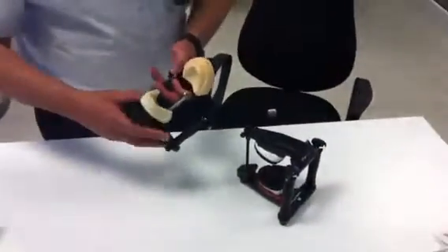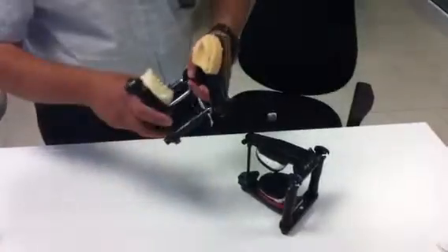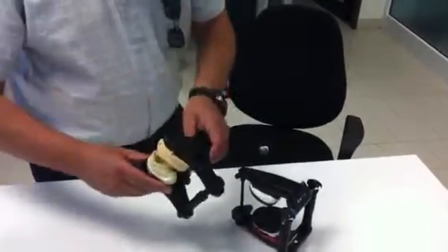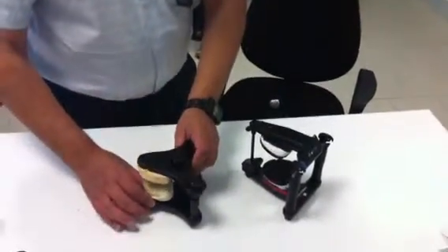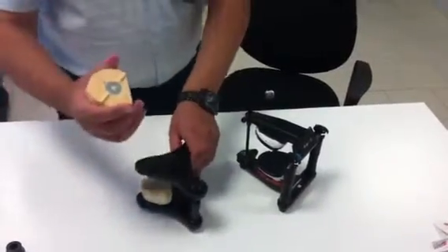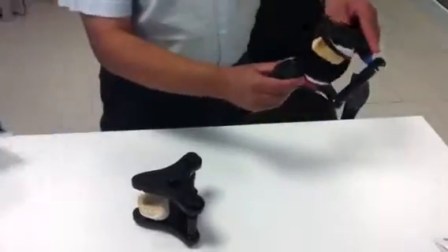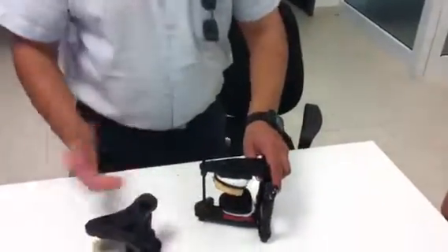The Fast Pro Tech Articulator has very strong magnets — this part can come off. There is no bar in the front, so the technician can work without any restrictions. If you have a facebow, you can transfer the actual model straight onto your larger articulator and carry on with the work there. So it's perfect all around.